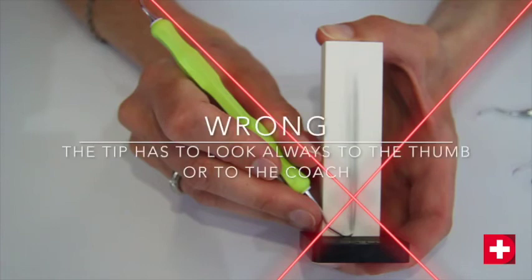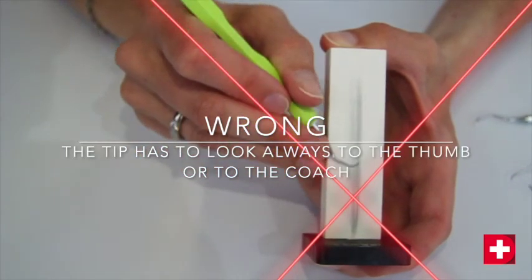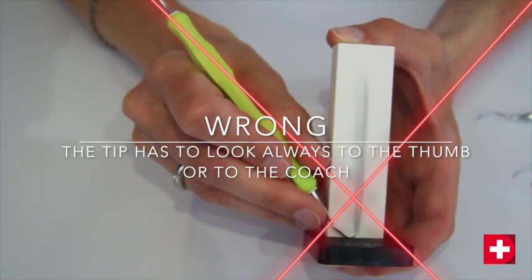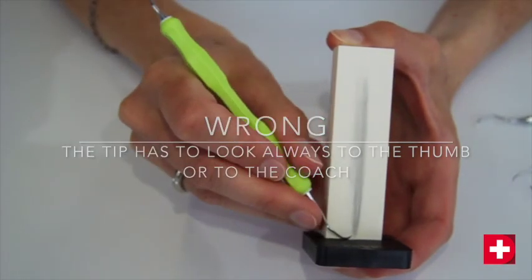This position is incorrect. The red lines show that the blade is not along the axis of the stone, and one sees that the handle is not at a right angle to the stone.